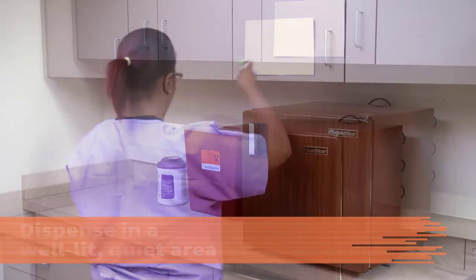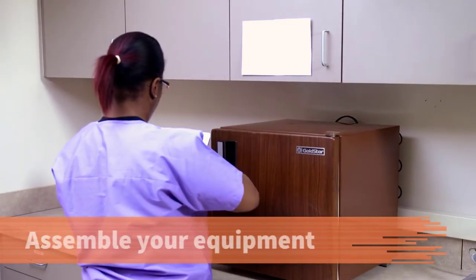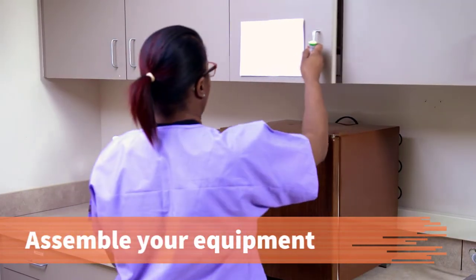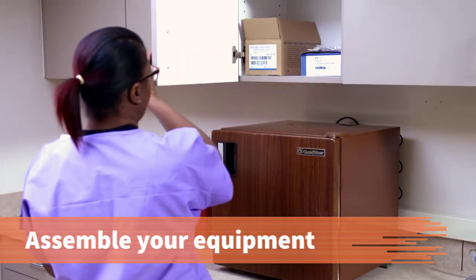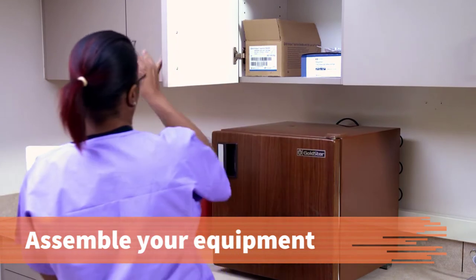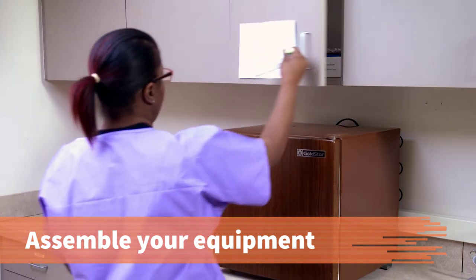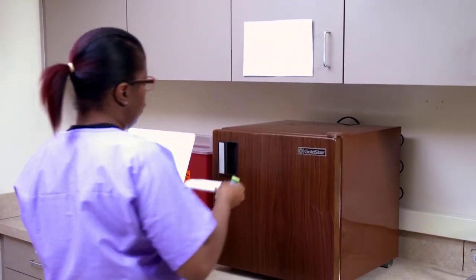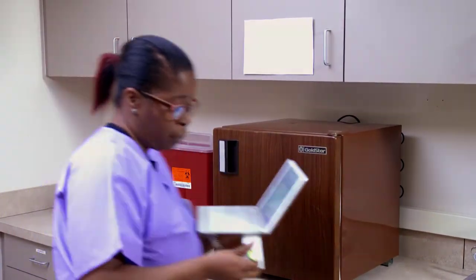Assemble the required equipment. Choose the correct syringe and needle unit depending on the site of administration, patient characteristics, and the amount of medication to be injected.